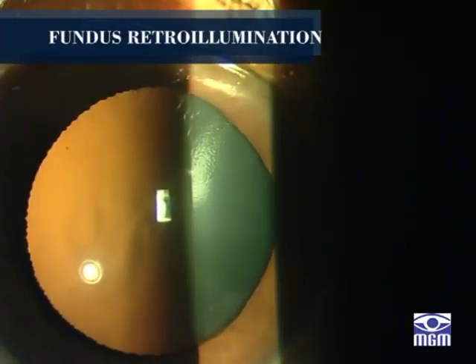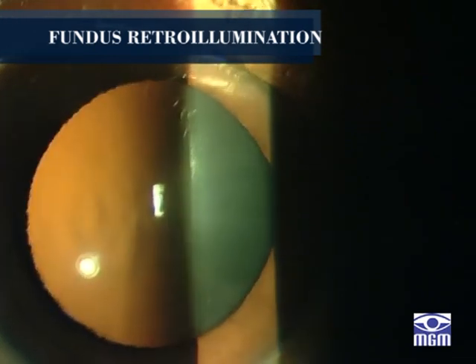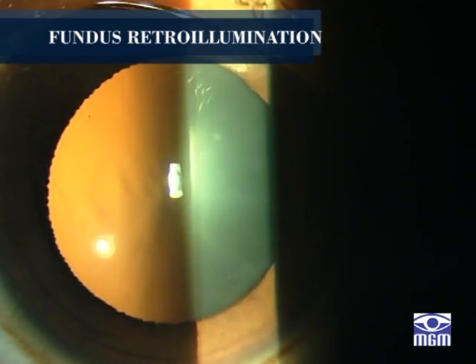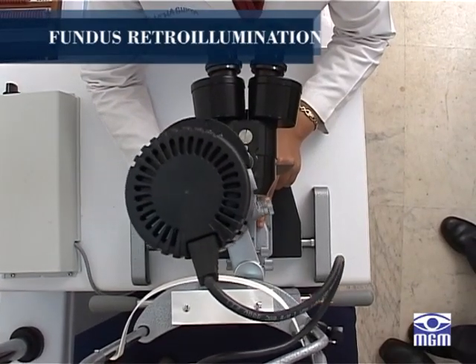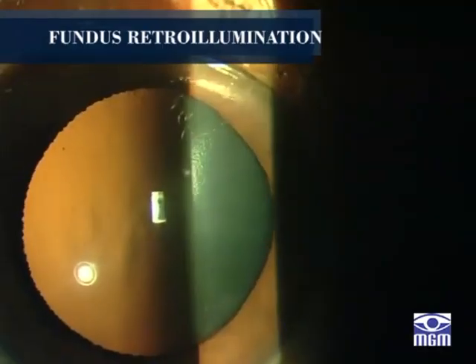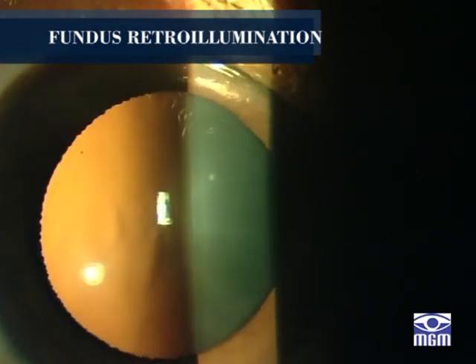In fundus retroillumination, using the light reflected by the retinal pigment epithelium, the anterior vitreous, lens and cornea may be examined. The slit illuminator is placed into an axial position with the biomicroscope and the light is introduced through a dilated pupil to illuminate the fundus.